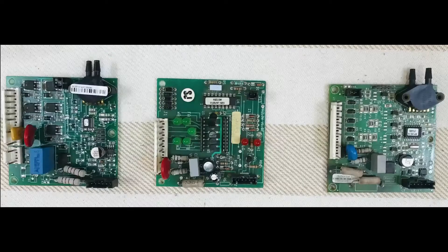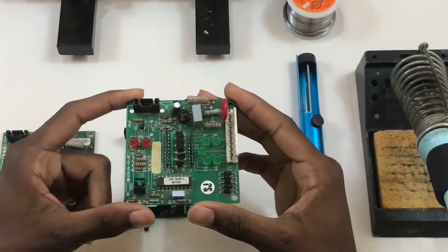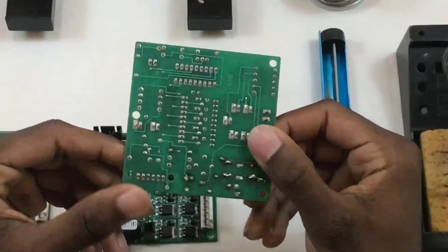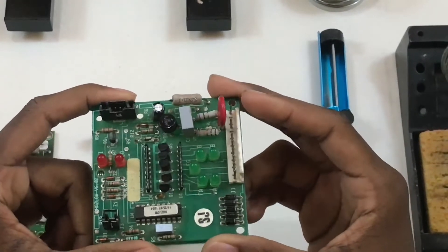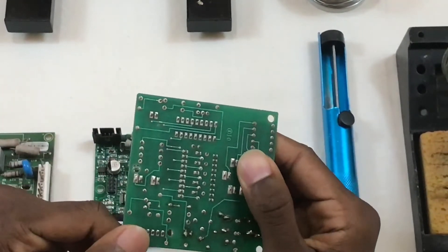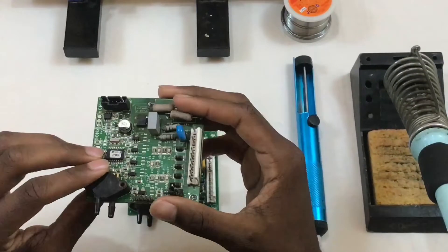There are three generations of the AirSafe control board. The first generation uses through-hole mounting technology to mount the components on the PCB. As you can see, all the components have leads that go through a hole and protrude to the bottom where they are soldered. In the first generation, the board also has LEDs that correspond to the solenoid valves on the concentrator, and these LEDs protrude to the bottom.